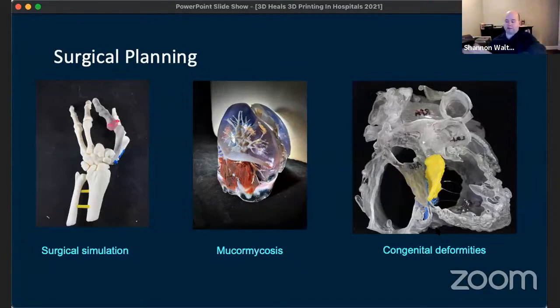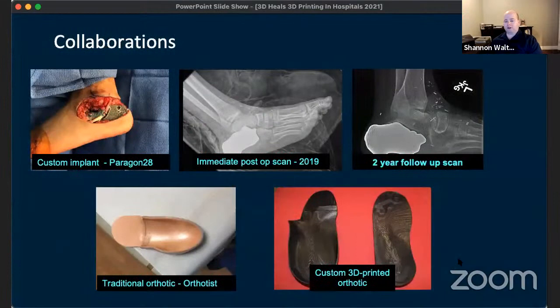This is kind of a cut plane that Karen was mentioning. We sliced it along a certain plane so that we could see right in there and see the valve and the ASD relationship. There's another piece that would go to this that shows the VSD that would be in front of this. We also have been collaborating with orthotics.